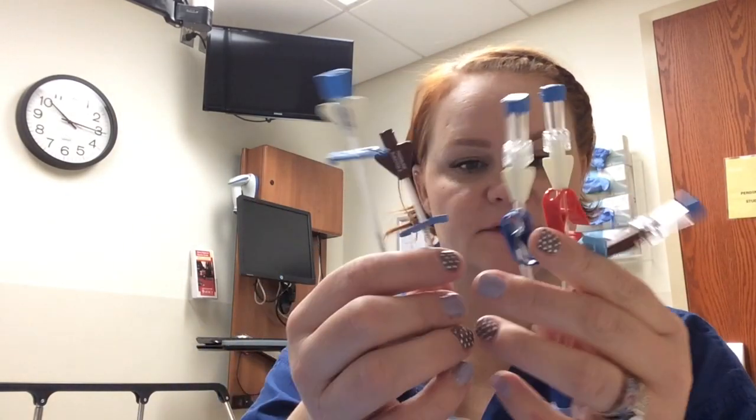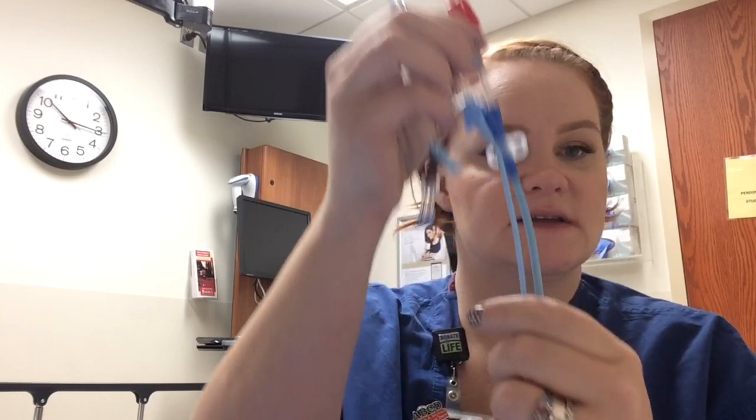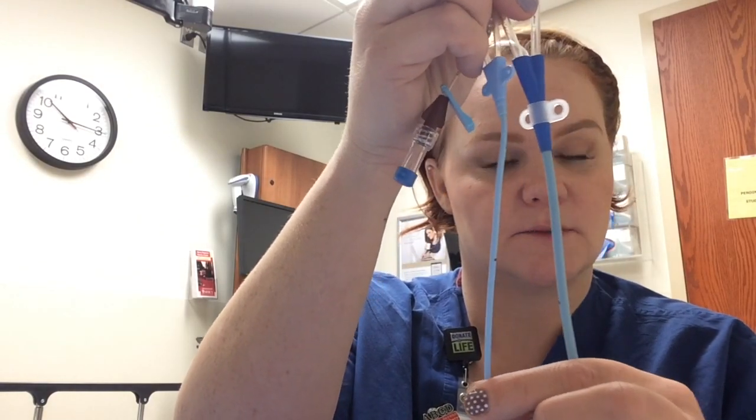This is an example of the double central line, and this is an example of the triple lumen. So you can kind of see the difference, and you can also see the difference in the bore of the lumen catheter.